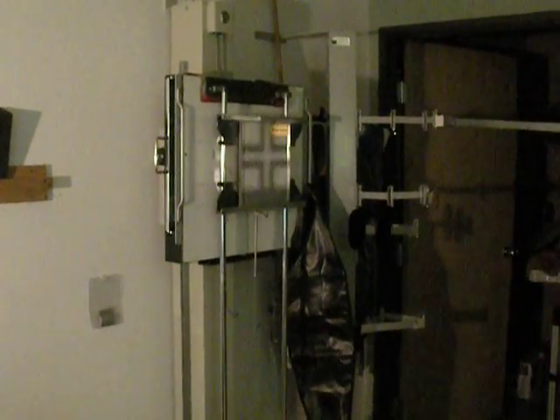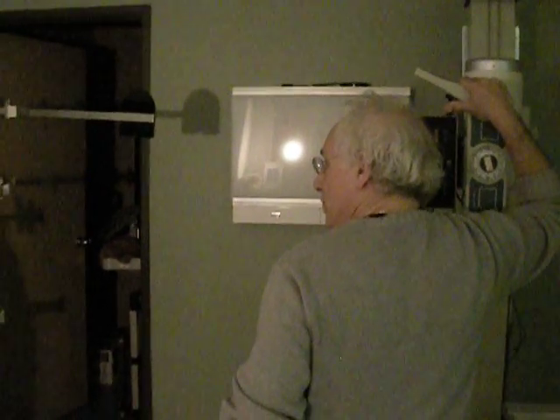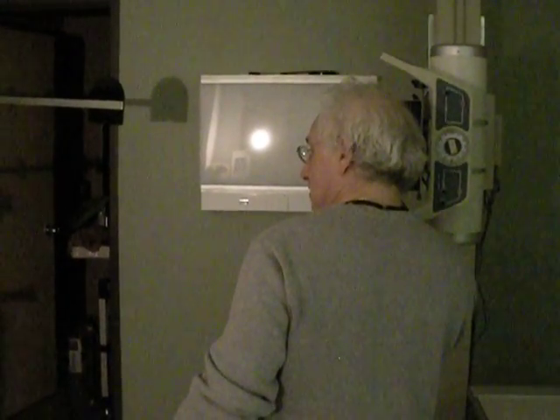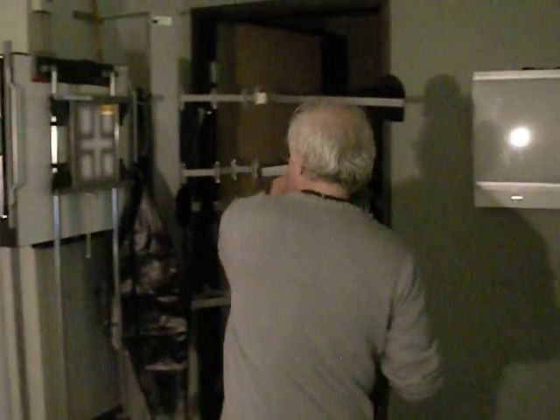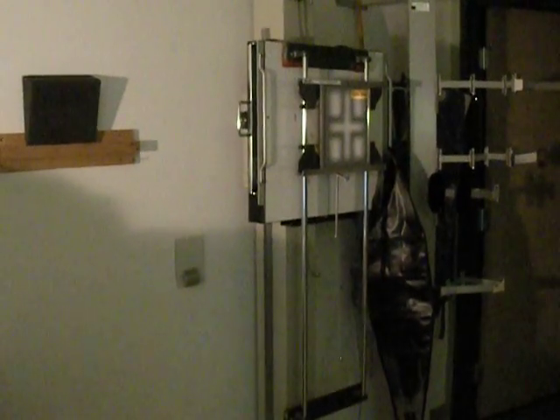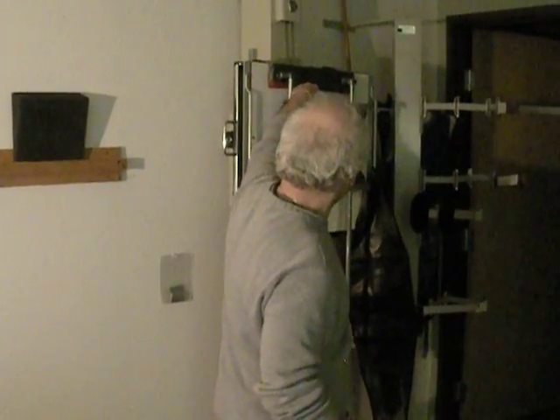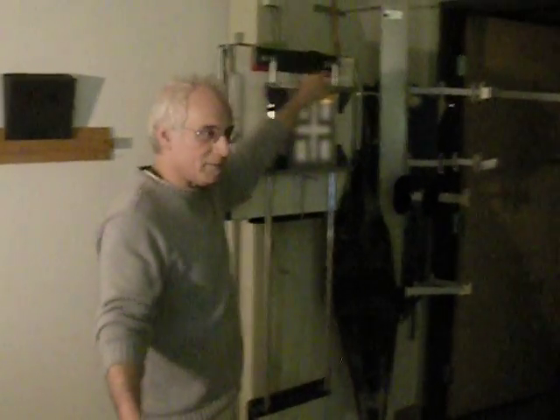And we're bypassing the grid. This is making use of the air gap principle that lowers dosage to the patient when the SID is increased. So we're increasing this SID to improve our resolution, and this allows us to do that without increasing the exposure to the patient. Now we bring our patient back here.